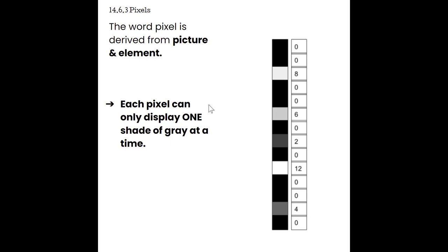Now we saw this image earlier, and so if this was just one scan line represented in our matrix or our checkerboard of our memory, each pixel would be assigned a number like we're seeing along the side here. So this pixel got assigned a zero, so when the display goes to read the memory, it'll know to put an anechoic pixel on the display. When it gets to this box, it'll know to put a light gray shade in. When it gets to this box, it knows to put a little bit darker gray shade in. So the pixels in the scan converter, the pixels in the memory, are assigned a digital number by the analog to digital converter.